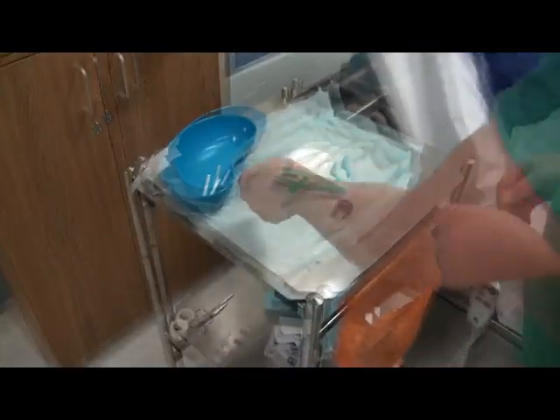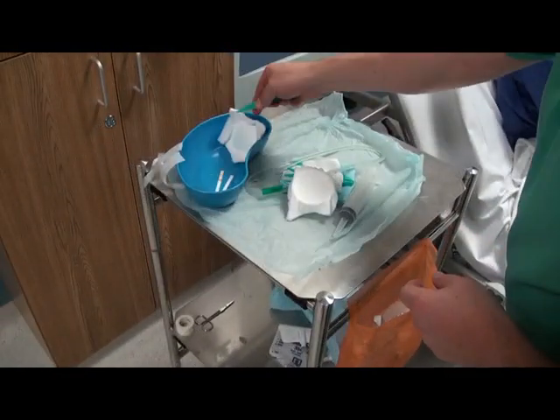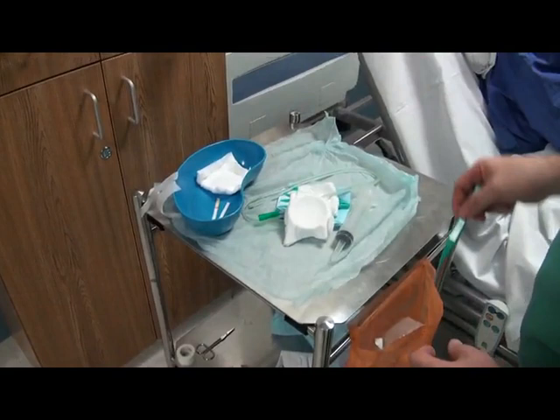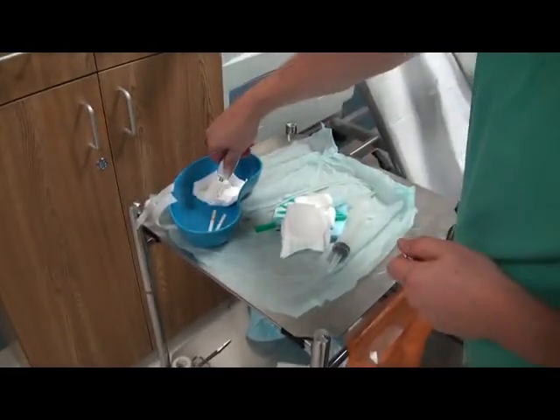It is important at this time to be organised so that the procedure goes smoothly and without interruption. Carefully place some gauze into the kidney tray, then apply some lubricant gel to aid tube insertion.